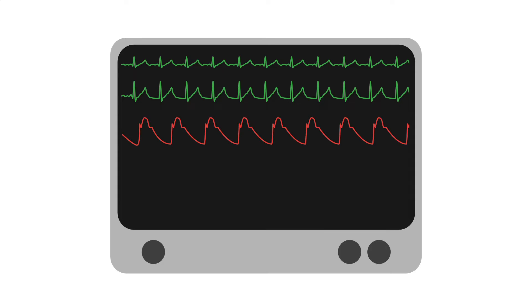Just underneath is a red line. This is an arterial waveform coming from the patient's arterial line, measuring systemic blood pressure.